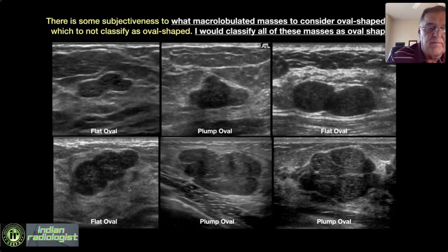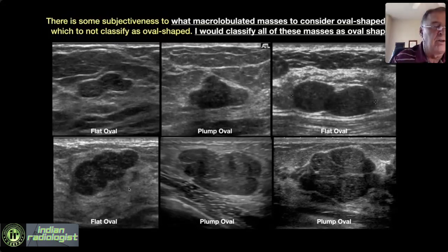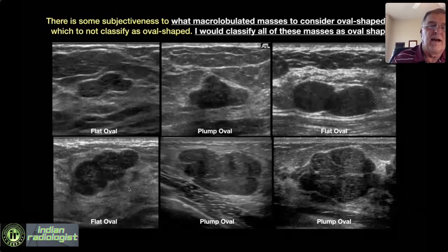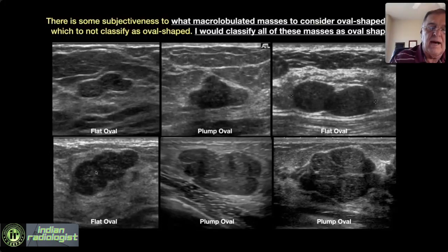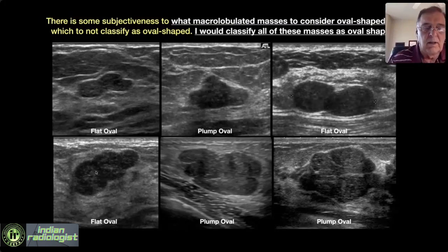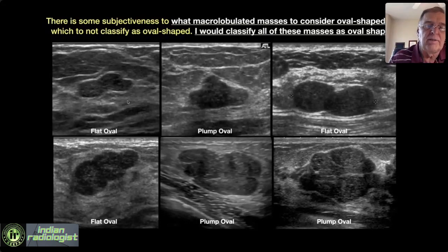In ACR BIRADS, all of these can appropriately be considered oval-shaped. In BIRADS edition 4, we separated macrolobulated from oval-shaped. In edition 5, we decided to include macrolobulated together with oval-shaped. Flat oval means the maximum diameter in the horizontal plane divided by the maximum AP dimension gives a ratio greater than 2:1. Macrolobulated lesions with a ratio less than 2:1 would be plump oval. All of these, even though macrolobulated, can appropriately be considered oval-shaped in BIRADS edition 5.